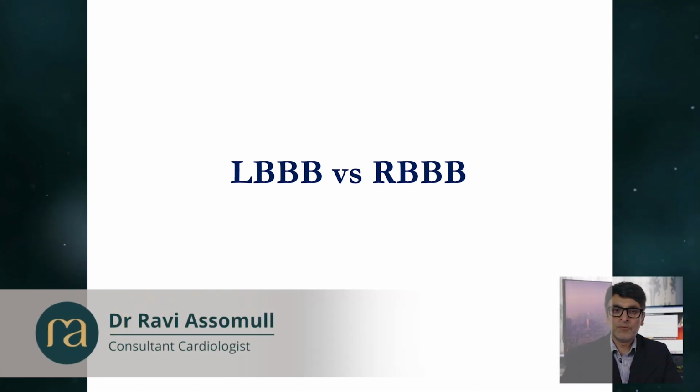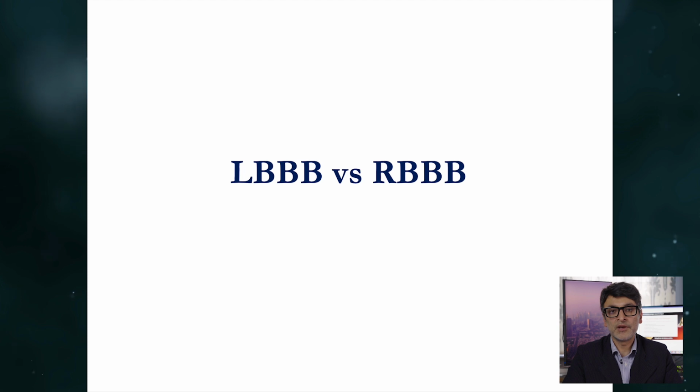So what I've noticed is there's often quite a difficulty in primary care for identifying left bundle and right bundle branch block. First of all, identifying it. Secondly, differentiating the two traces. And it's important to be able to do this really with minimal effort because the repercussions clinically are actually very different. So what do we mean by left bundle and right bundle branch block?